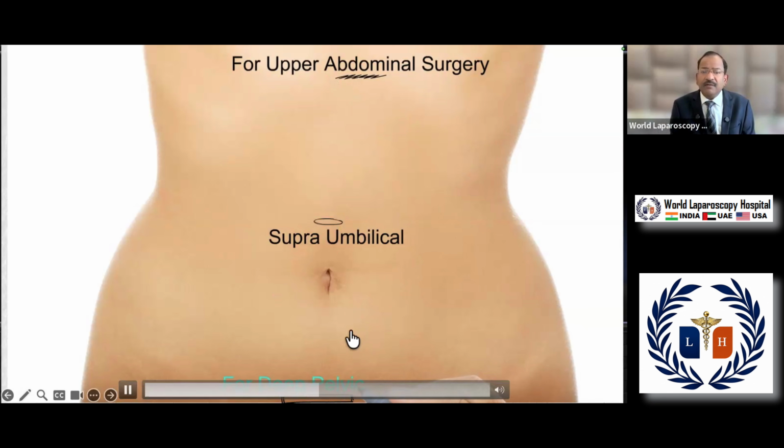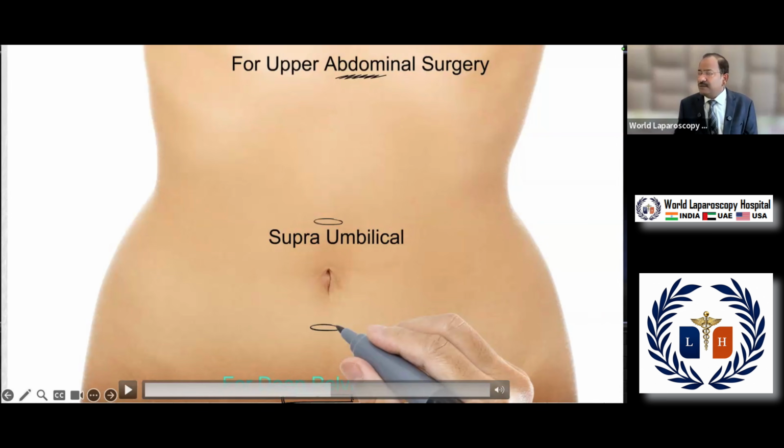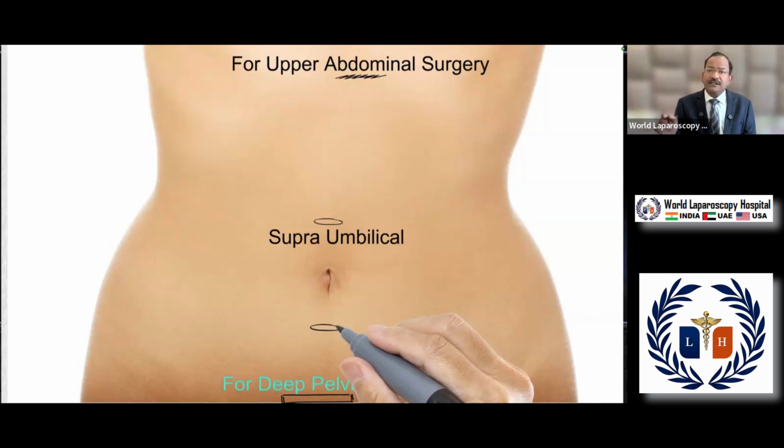Now coming to infraumbilical. Infraumbilical is less used, but for deep pelvic surgery you can use the infraumbilical port. Like sometimes some surgeons use infraumbilical for ventrosuspension, or presacral neurectomy or LUNA. Infraumbilical is also very popular in single puncture sterilization with the laparoscope, and in tubal sterilization camps, they use infraumbilical.